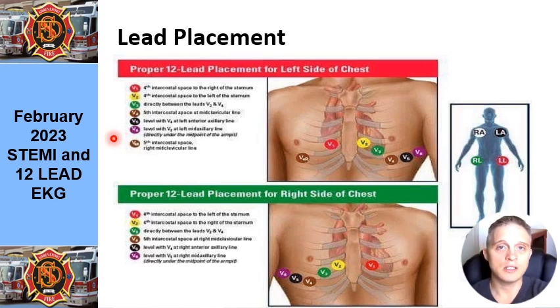This is something that our EMTs are very capable of doing, and it's not something that if you have an EMT that you should be doing for them. This is a part of their repertoire. So one of the things that we need to understand is there's two different types of 12 leads, and even some would argue a third. There's the left side, the right side, and then there's the posterior.